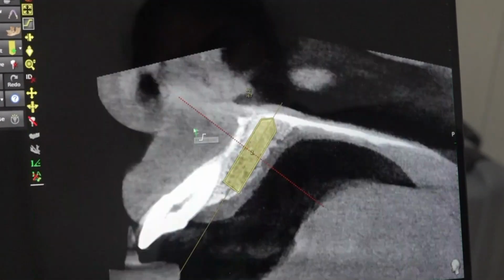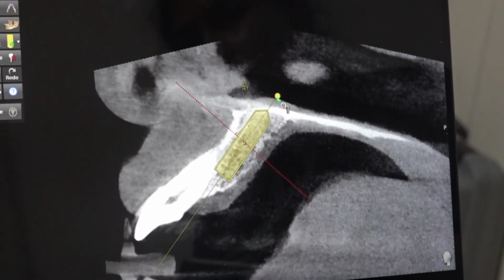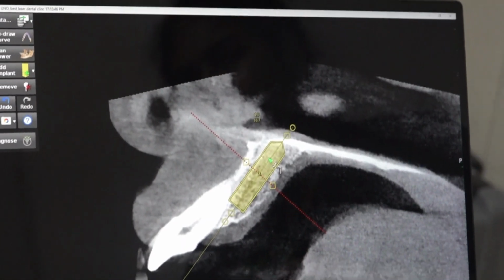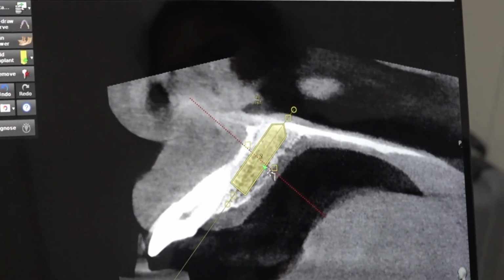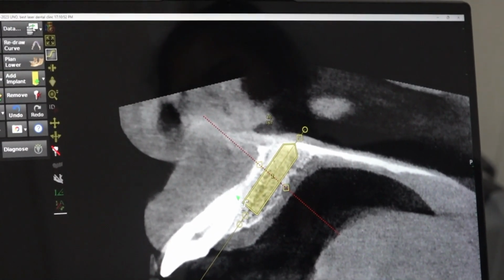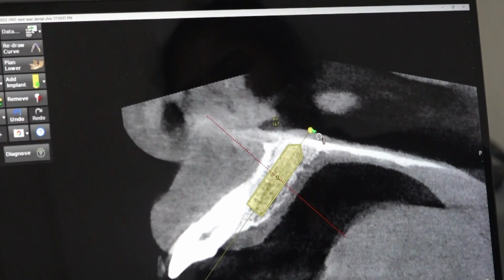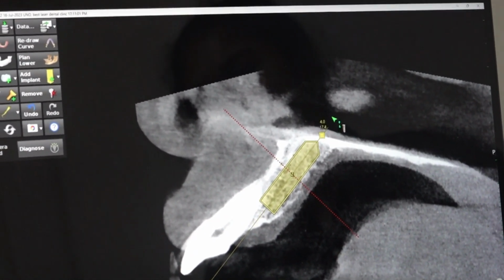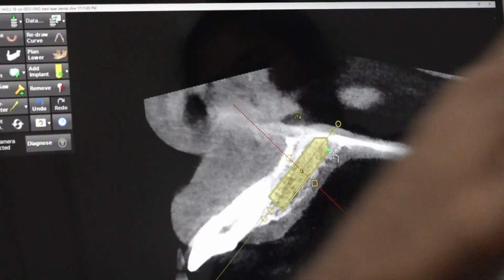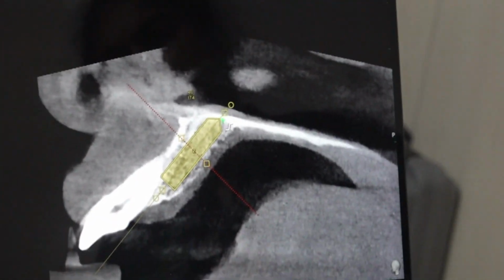Okay, so we didn't see the clinical picture and all. We just jumped into the radiographic planning, which we should not do. So how much alveoloplasty we have to do, we don't know. Okay, so tentatively what we will do, we will do alveoloplasty almost till the apex. Okay, we will leave a little bit of apex of the socket. You have got a good bone here, luckily. Okay, even the nasal floor is around 2000 HU, which is excellent.